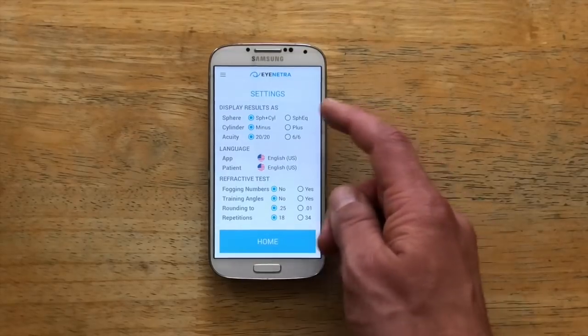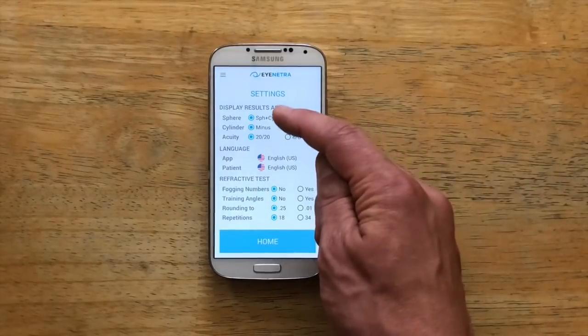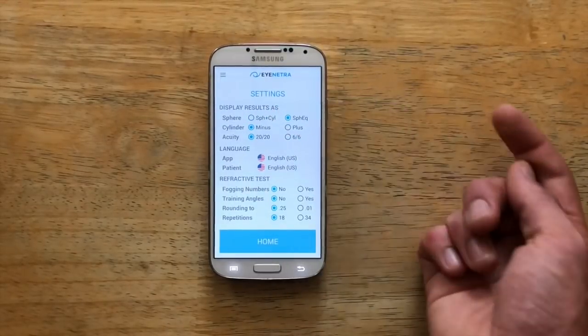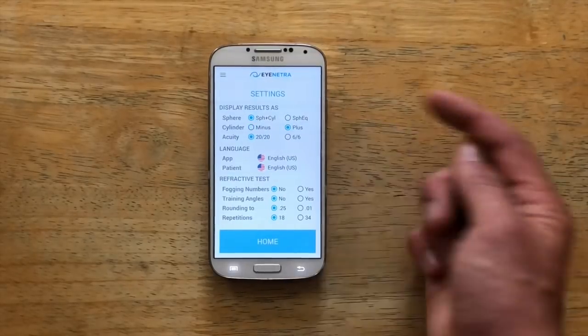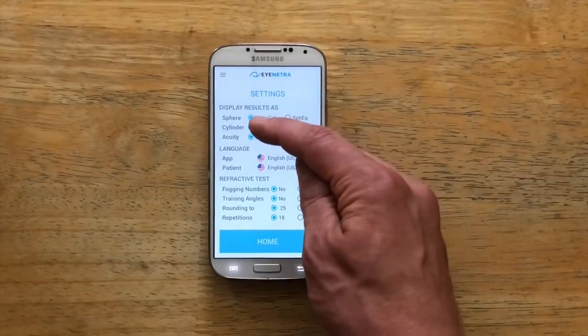At the top we can make some adjustments to how our results are displayed. You can choose the standard sphero-cylindrical notation or a simpler output with just the spherical equivalent — great if you're offering a smaller selection of glasses powers without an astigmatic correction. You can also choose between plus cylinder and minus cylinder notations. In the US, ophthalmologists tend to use plus cylinder while optometrists tend to prefer minus.